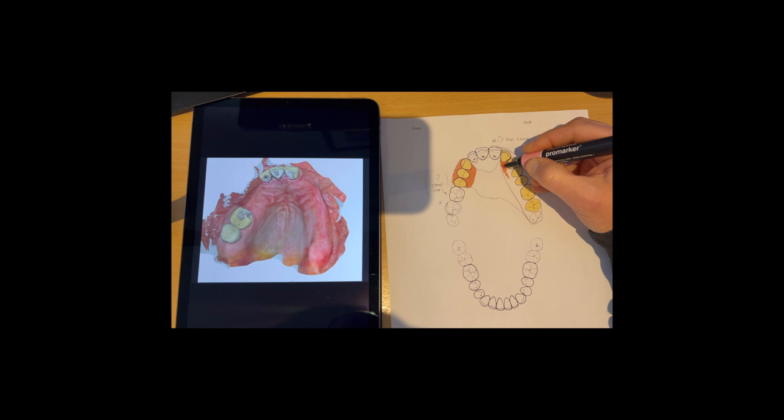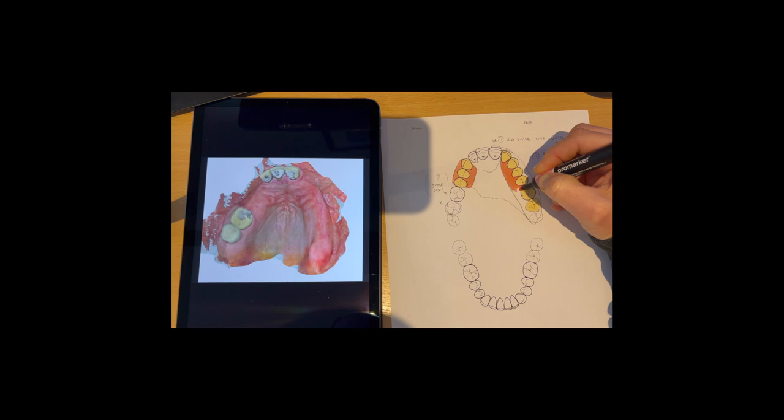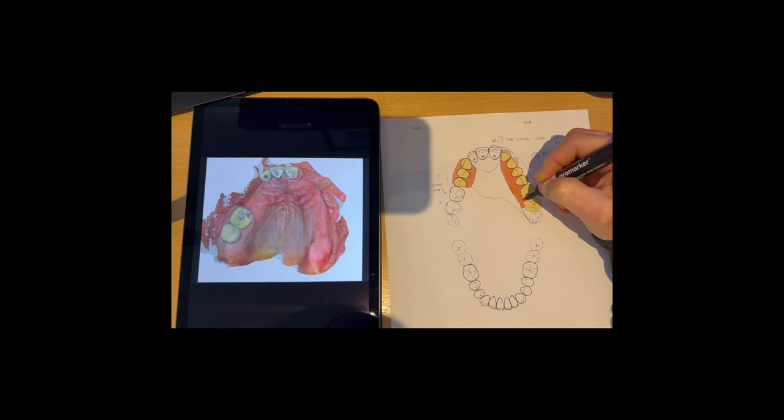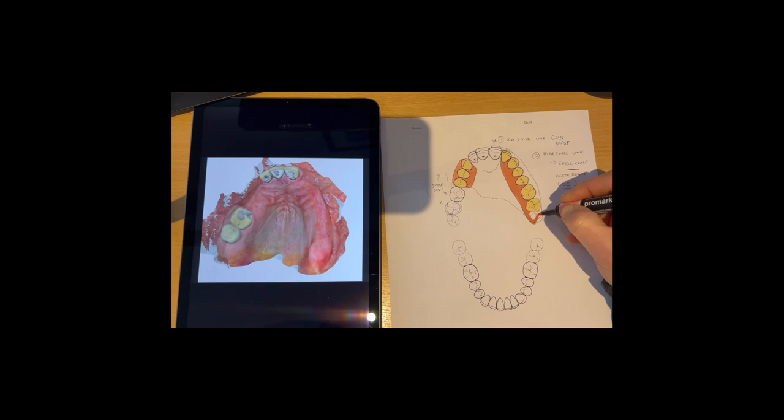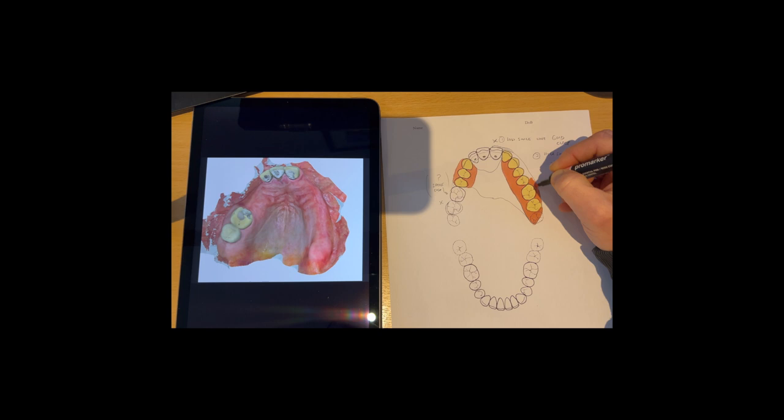And this all allows the whole denture to become a splint and help to reduce the potential for fracturing and cracking of the underlying teeth there. So this is fully extended around the back of the tuberosity there, all the way back. That's really good.